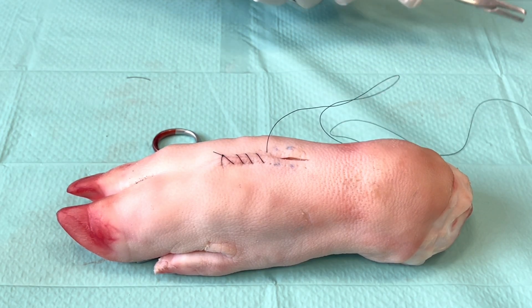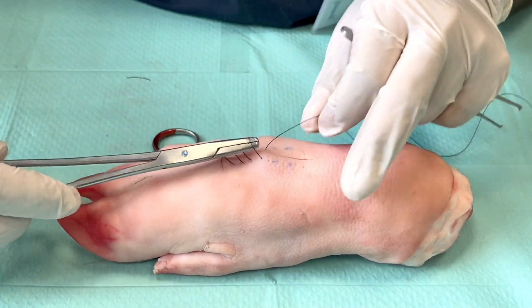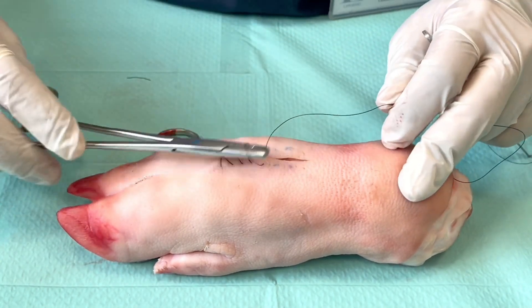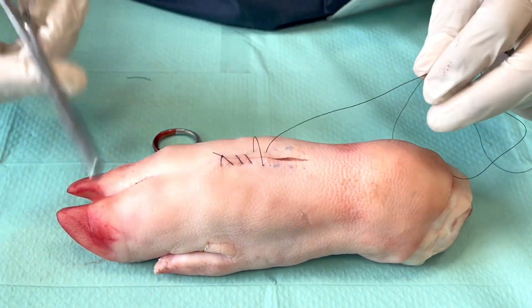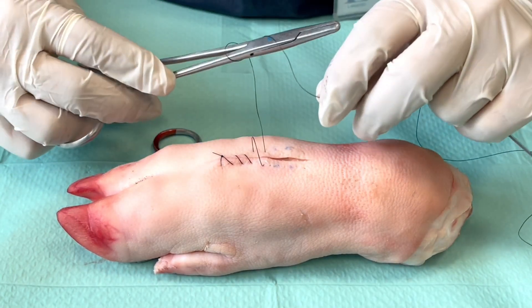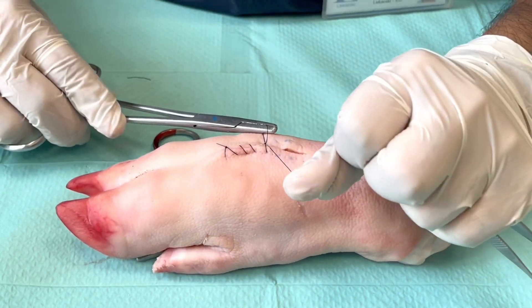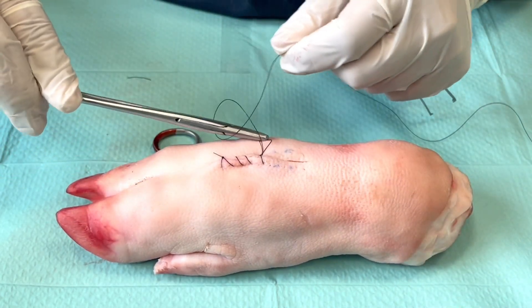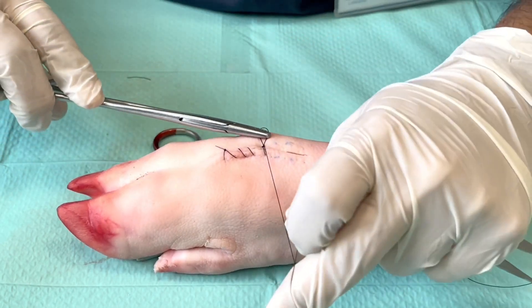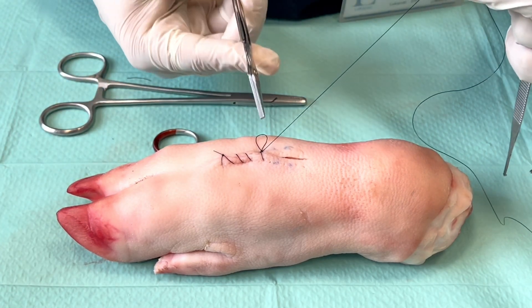What you need to do is use your last bite, make it into a loop, and this is going to act as your short end. Identify the V in between this loop and your long end, then perform the instrument tie in the same way, starting with a two-rotation tie first, and then two more ties with one rotation each, remembering to alternate your ties so that it sits down better. And there we have it — that's how you do a simple running or simple continuous suture.